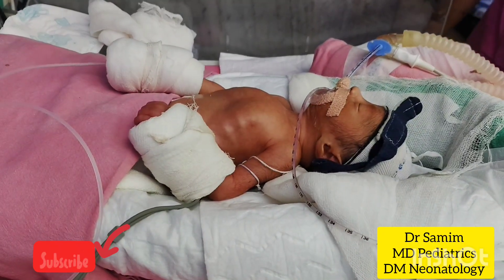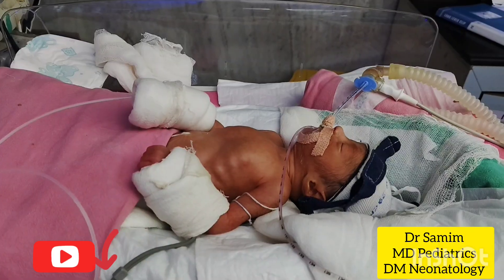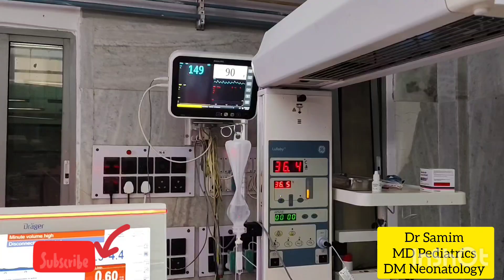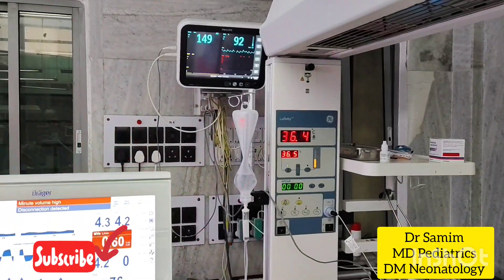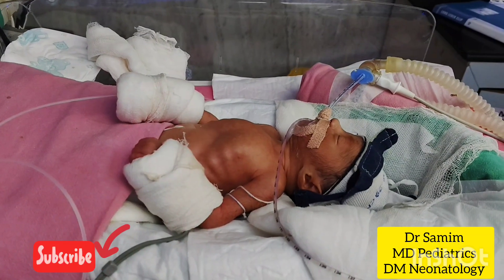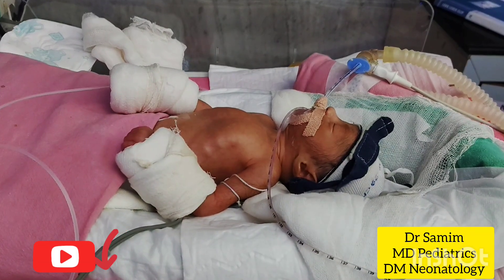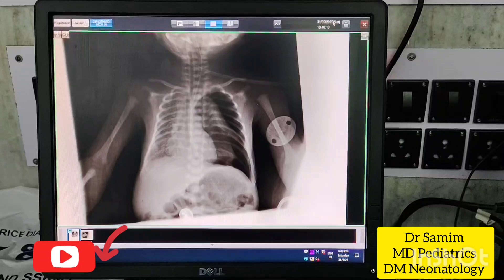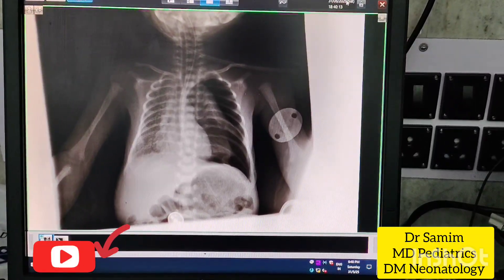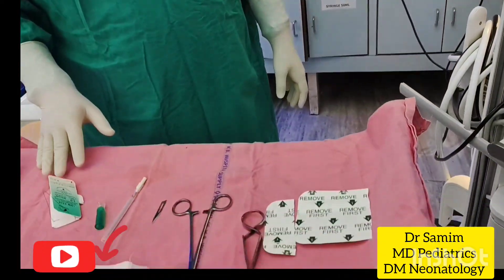This is a preterm infant of 32 weeks of gestational age who develops increased respiratory distress and desaturation after surfactant administration at day one of life. Here we can see asymmetry of the chest wall and the left chest is more bulged out. Left-sided air entry is also diminished. We have done a chest radiogram and found left-sided pneumothorax. So we are doing immediate chest tube insertion in this newborn.